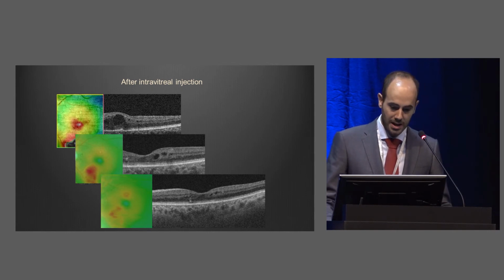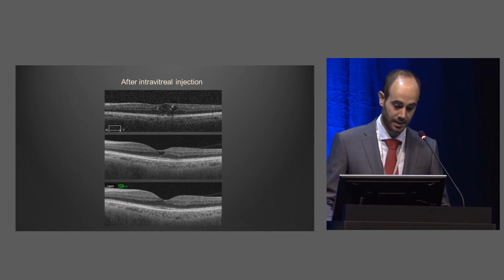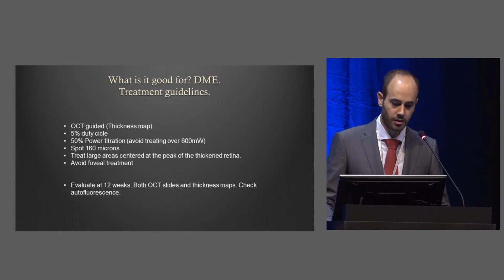So I treat it with intravitreal injection, steroids, anti-VEGF, depending on the case. We obtain a nice response. We have turned this case 3 scenario into a case 1 scenario, which we now can consolidate with laser and obtain a nice, long-lasting result with just 1 injection and 1 laser session. One more case, also fovea involved. Nice response to intravitreal and nice consolidation.